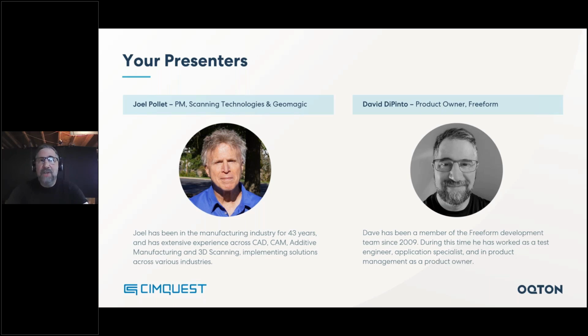So for me, I am not a medical professional. Please be kind to me. I'm going to do my best, but I've learned an awful lot over the years, and I hope to be able to show you the power and the majesty that is Geomagic Freeform. So without any further ado, we can get into the webinar.